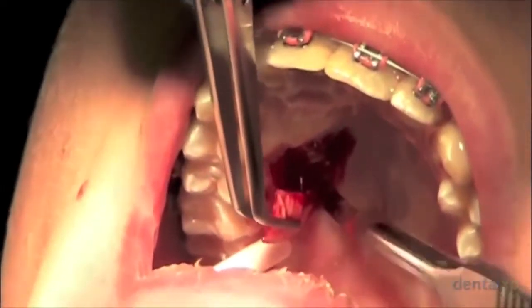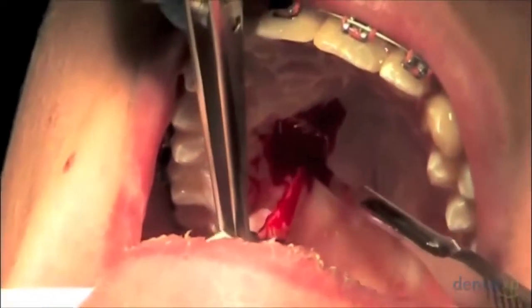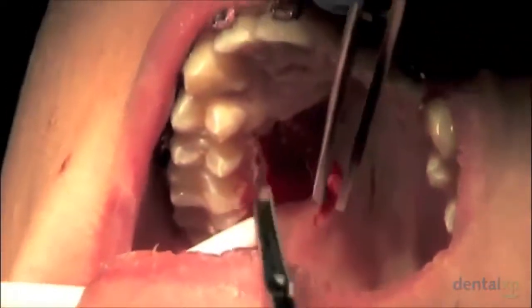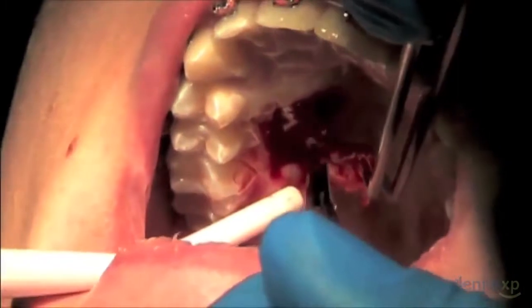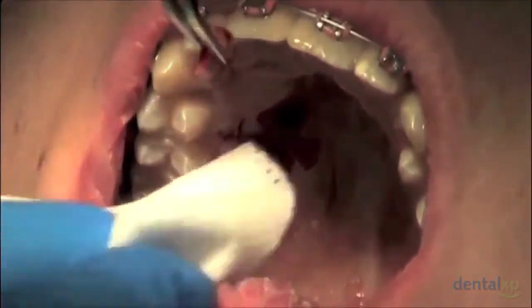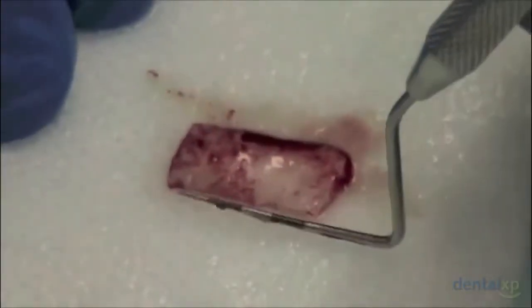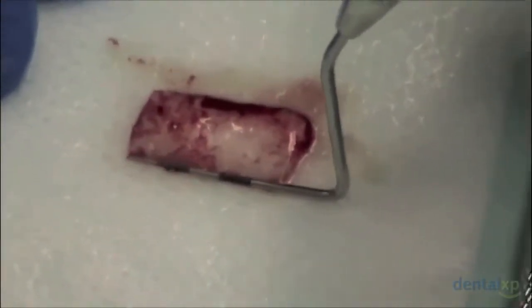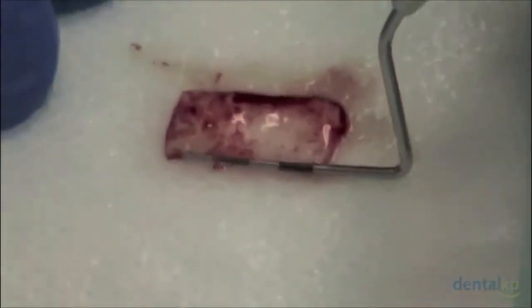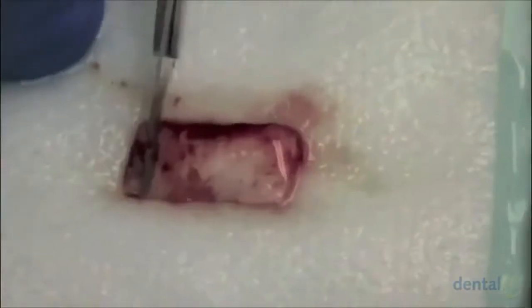At this point, all I'm doing is using a typical cotton plier to aid in the separation of the donor tissue from the palate. Once again, this is all done via sharp dissection, and once the tissue has been removed, a moist cotton gauze is placed to help achieve hemostasis. I also provide my patients with an acrylic stent to aid in hemostasis once they get home.